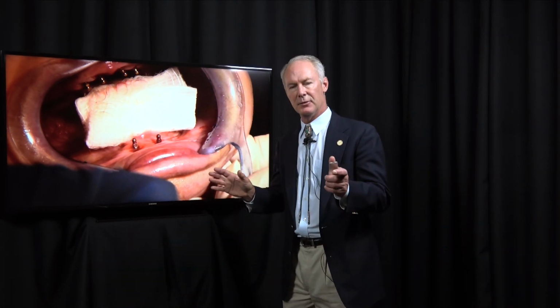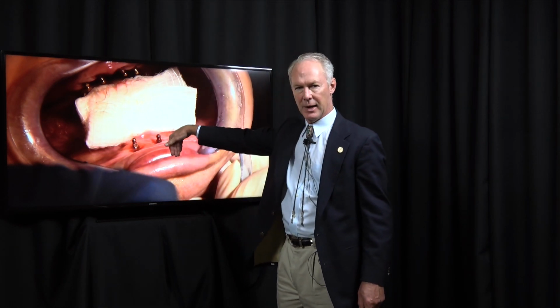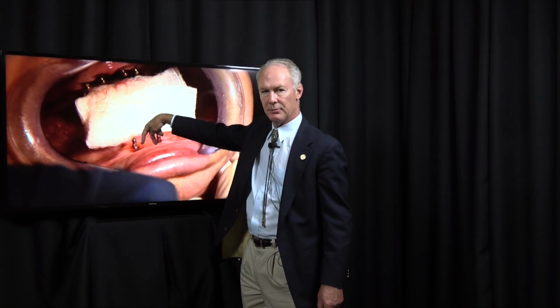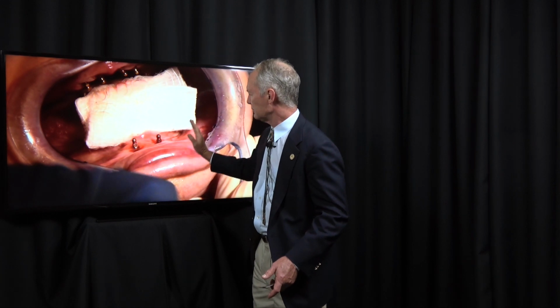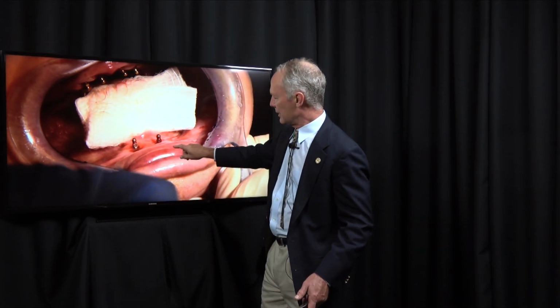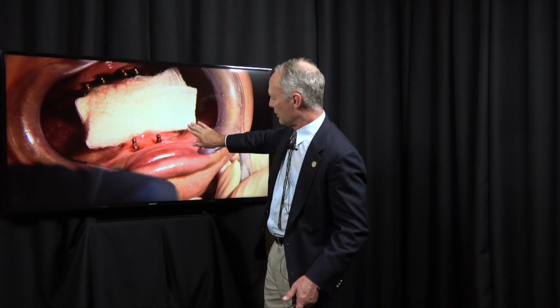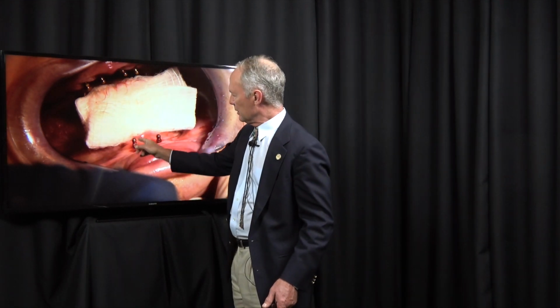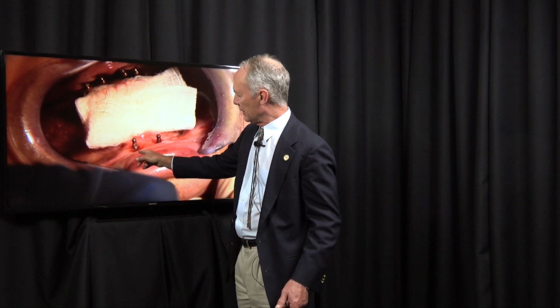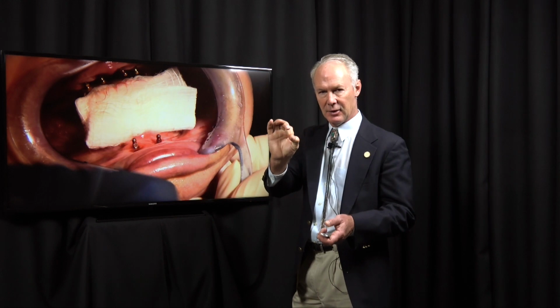This is a very easy way to do that because you know you're safe in the very anterior part of the mandible. So once these two implants have been placed, take a periapical radiograph of here and another one here. On the left side, you want this implant included in the periapical radiograph and get as far back as you can so you also include the mental nerve. On this one, again, you want that small diameter implant included in the radiograph, and then you want the radiograph to extend far enough distally to capture the mental nerve so you can see it on the radiograph.